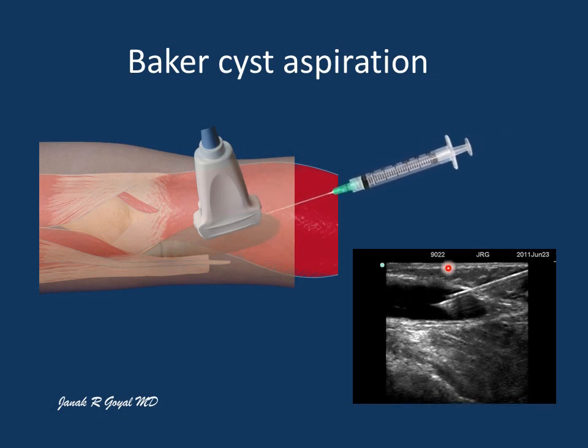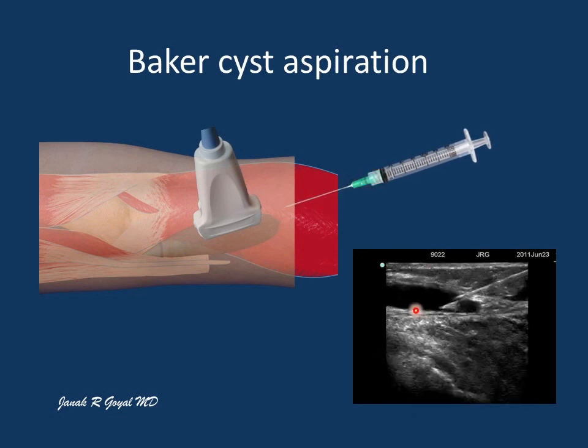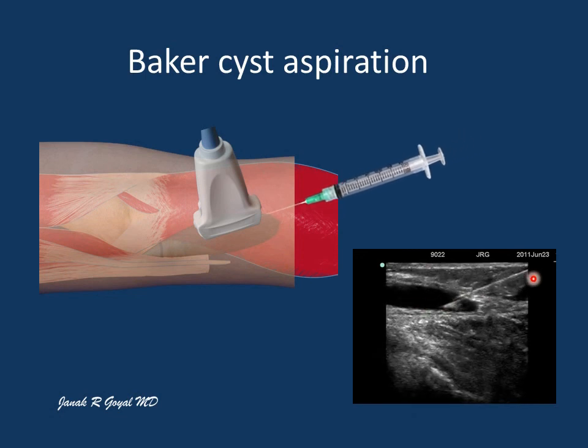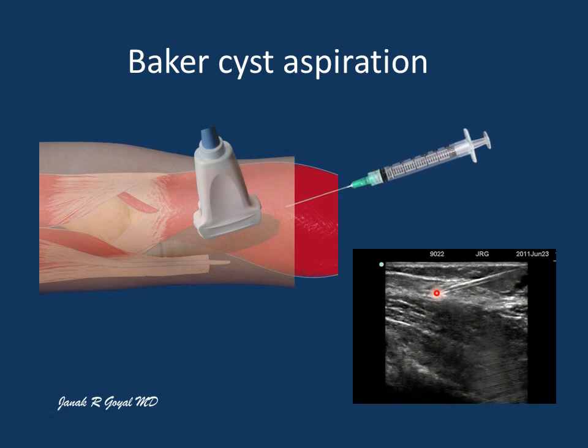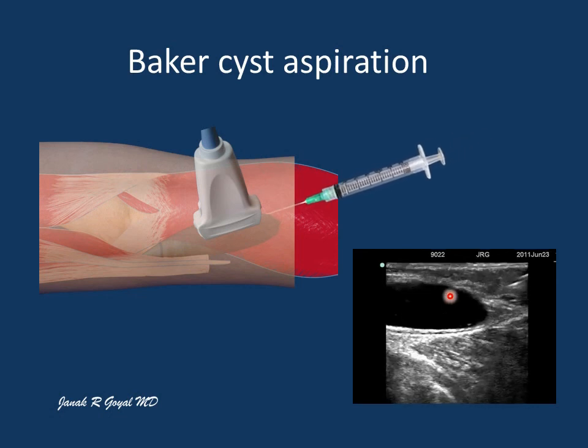Here is your sonographic image showing the Baker cyst being aspirated with the in-plane approach. Here is the needle in the lower pole of the Baker cyst, and the Baker cyst is clearly aspirated and cleaned.